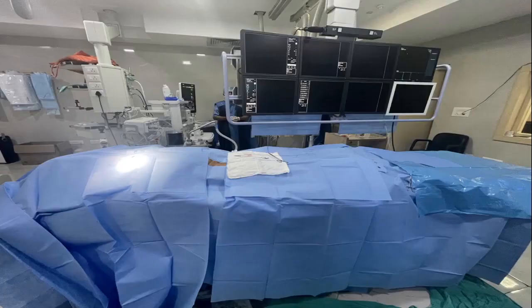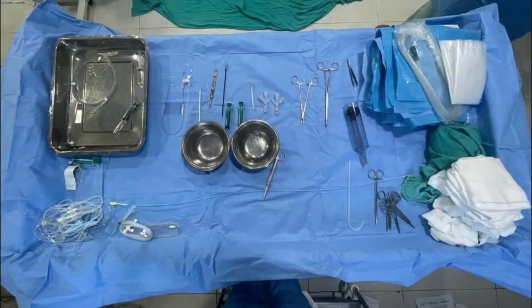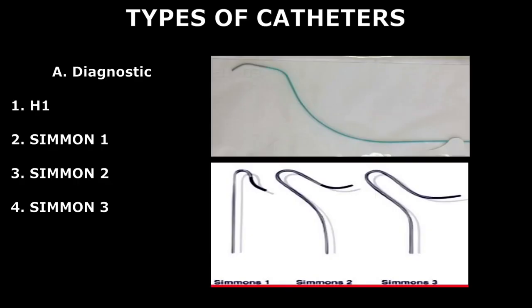The patient was positioned supine with a headrest, and arms were placed beside the body in extension with support. The sterile angiography equipment table should be positioned behind the operator, who faces the angiography operating table. The table should be long enough that catheters and wires may be stretched over it. There are multiple catheters, but use the ones with which you are familiar.